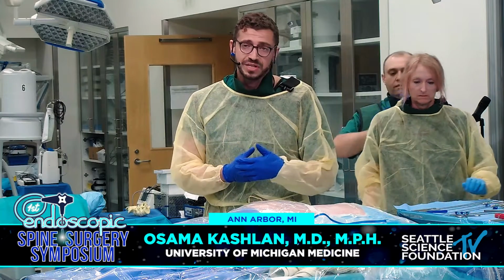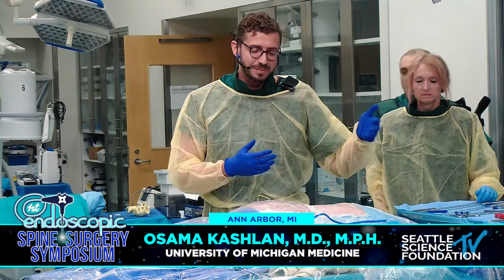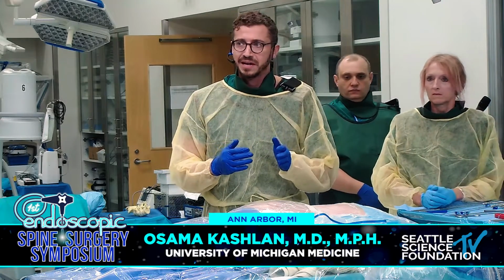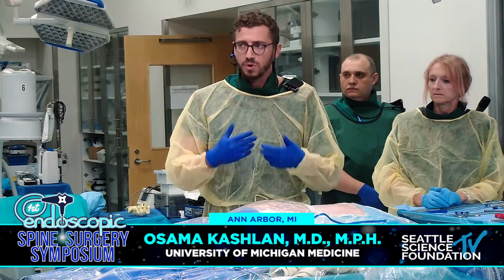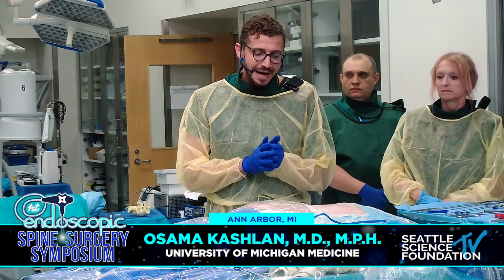The transforaminal route is a great approach to get discs in the lumbar spine, but also in the thoracic spine. L5-S1 is a little bit difficult because of the iliac crest, and for L5-S1, in most cases, you do the interlaminar approach, which you'll see in a little bit.